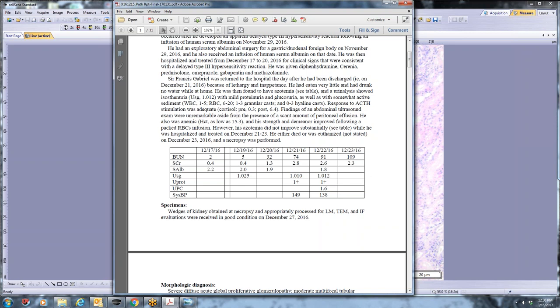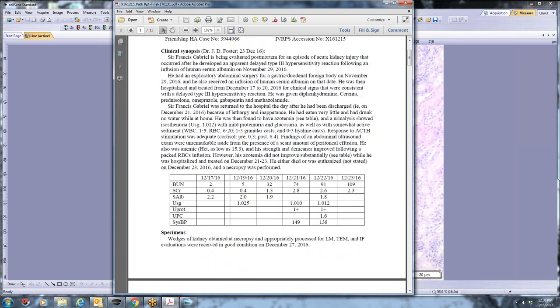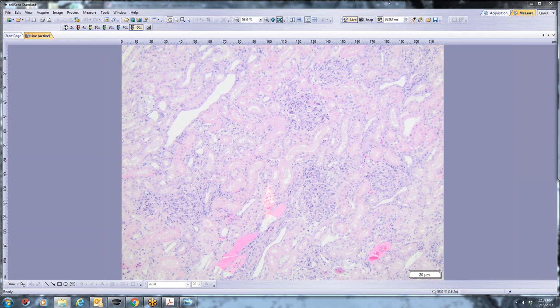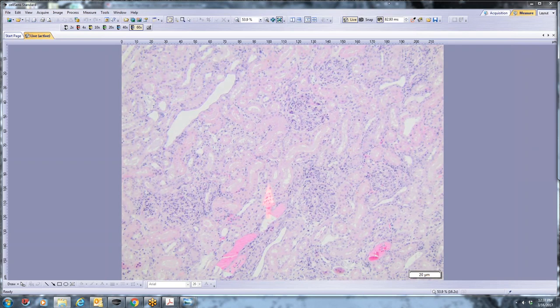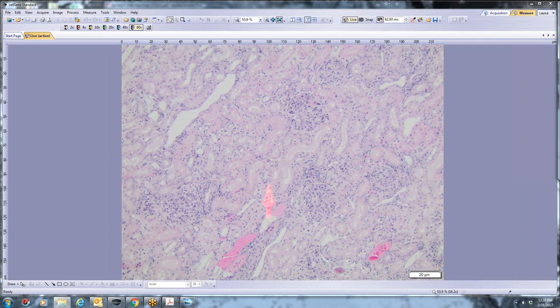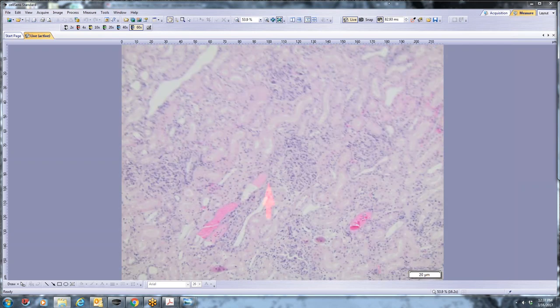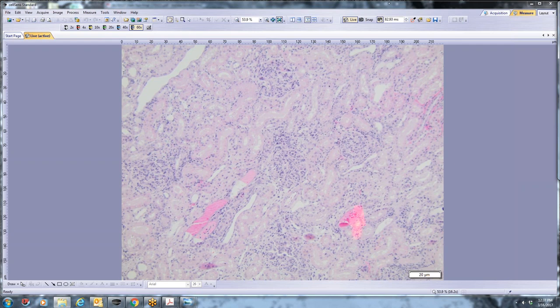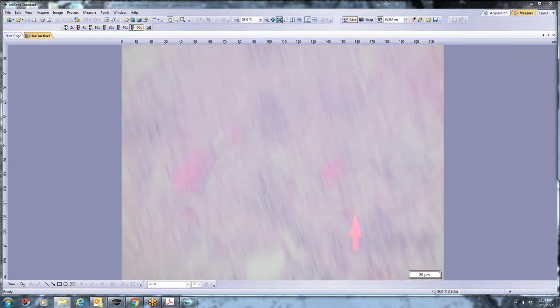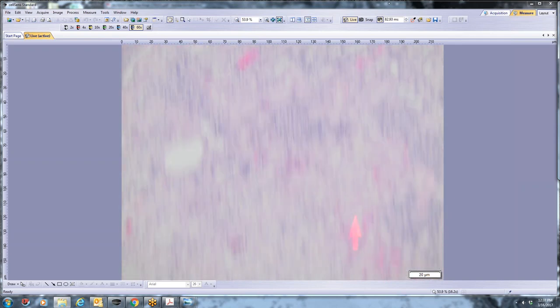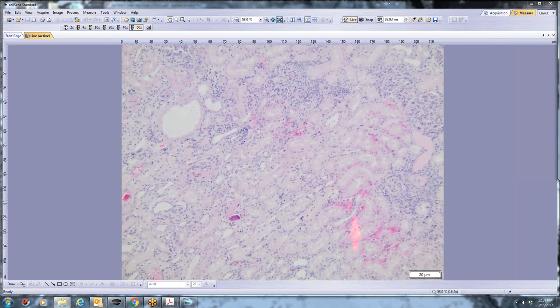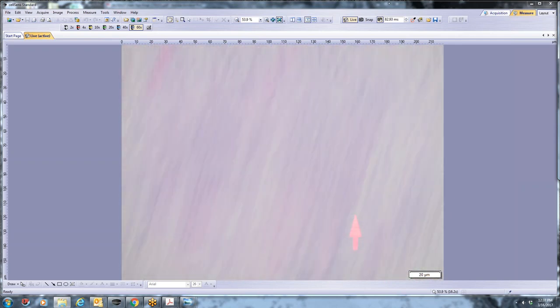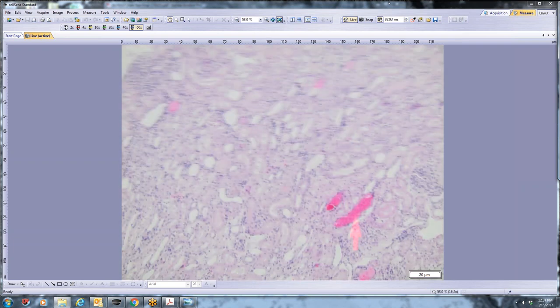Yeah, so we got this sample that came through. We have wedges, or sorry, cross sections of the kidney, and there's going to end up being somewhat of a similar repetitive story about the hypercellularity of the glomerular tufts, and that it is both in an endocapillary location and a mesangial location. I just want to point out at this overall mag is that we have a lot of these intratubular casts. Some of them have dense protein in them, and then some of them actually have red cell casts in them.